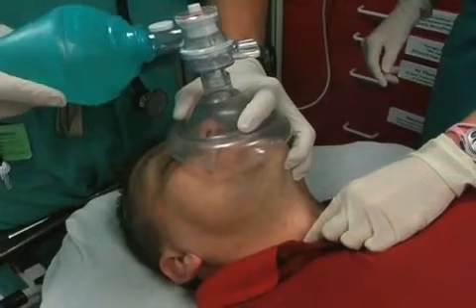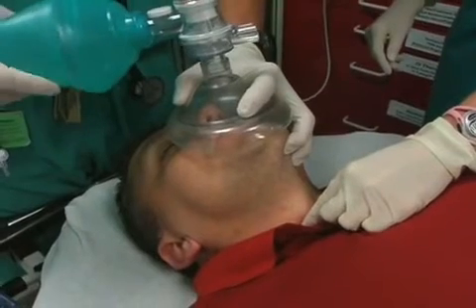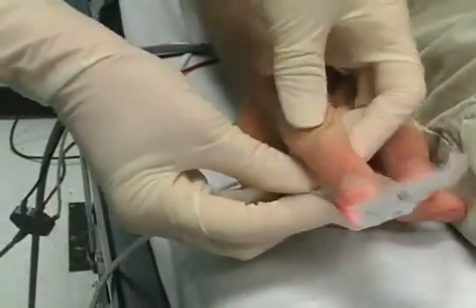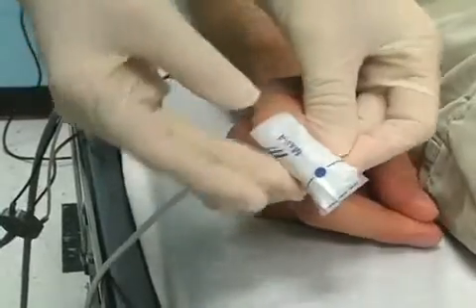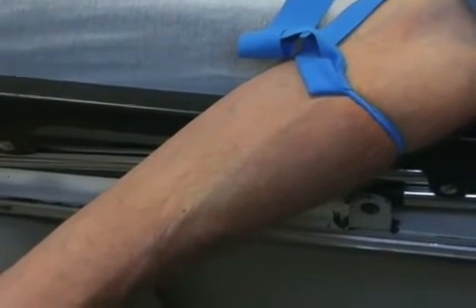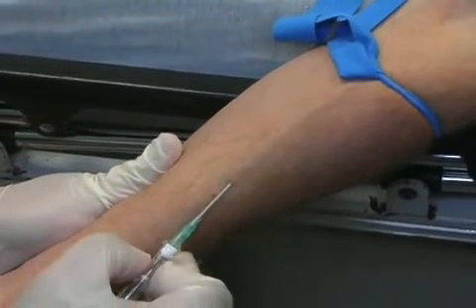Non-breathing patients should be ventilated using a bag valve mask device and using cricoid pressure to prevent aspiration. Vital signs must be monitored, and pulse oximetry should be used throughout the procedure. Intravenous access is typically utilized for drug administration, unless conditions allow for intubation without the use of IV drugs.